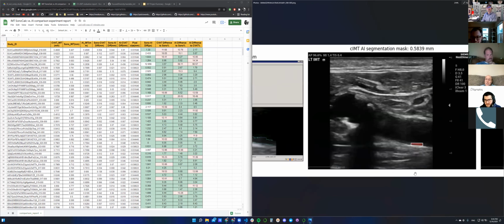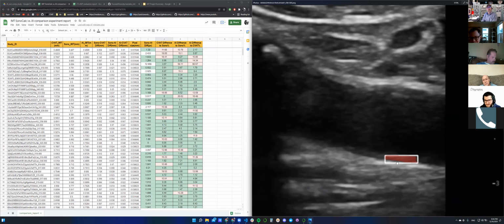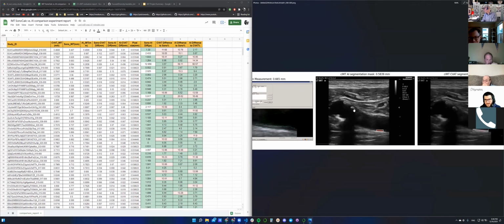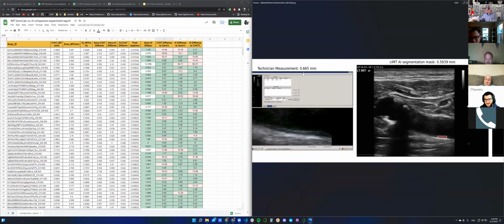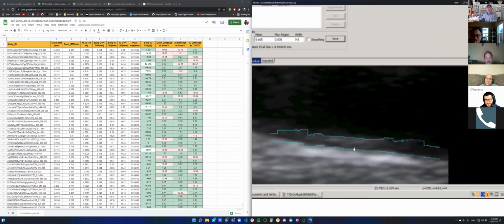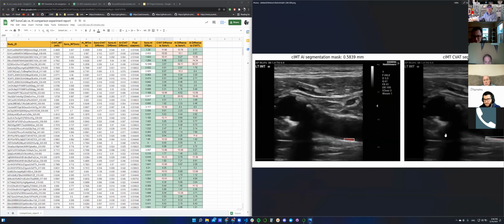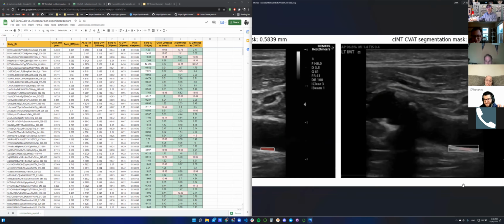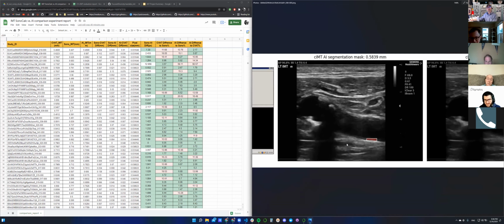Yeah. But even in that hard case where the contrast is a bit bad and blurry, we still get a small area and we actually get a number, which is very different than the ground truth one. But to me, those aren't great images. Ground truth doesn't seem very right. Agreed. Just out of curiosity for this one, what is the CVAT measurement thickness? I see that it's like 0.8, so there is a lot of variance in this specific example. Okay. But again, that's a very difficult image.